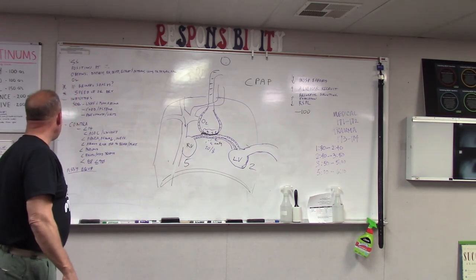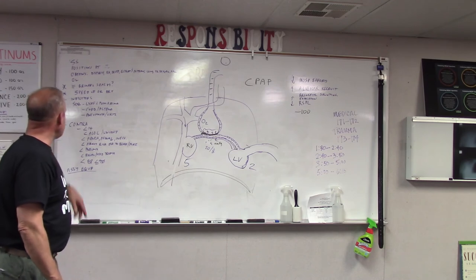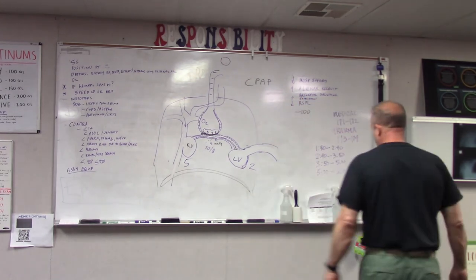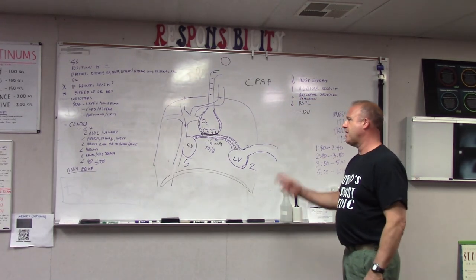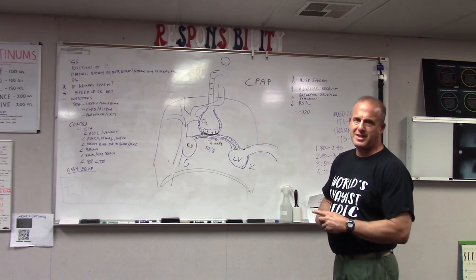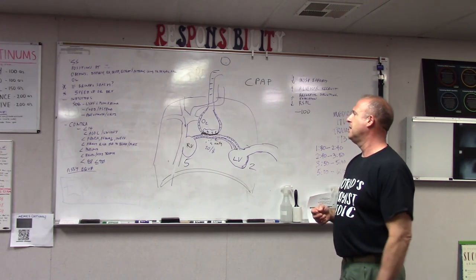Bronchospasm, especially on exhalation. Coming down, contraindications. Well, age in our county is a contraindication. If they're below 14, they say no. There's no reason for it. But then again, you hardly ever see someone who needs it that's not responsive to bronchodilators.